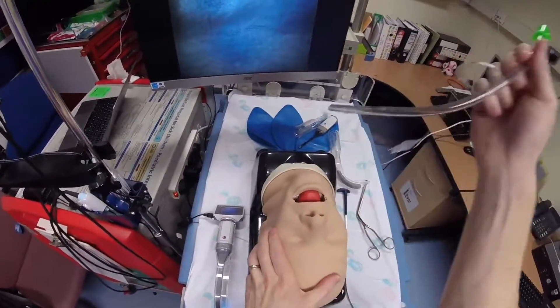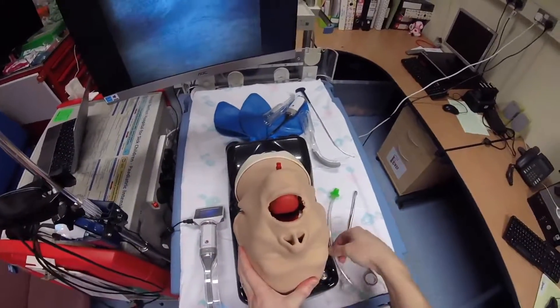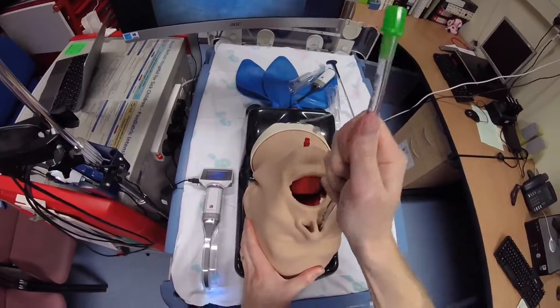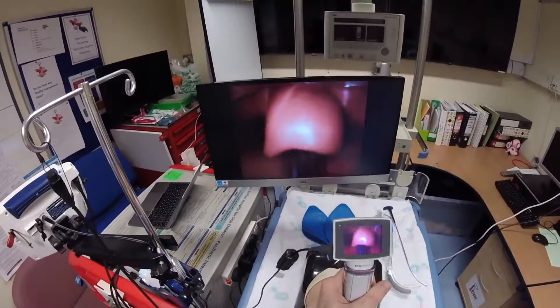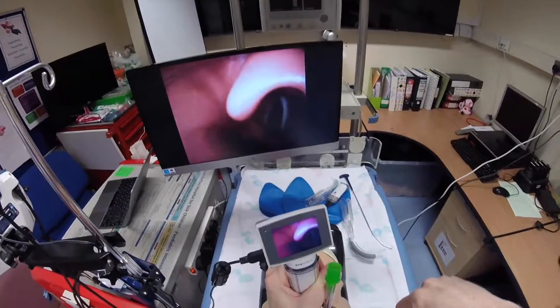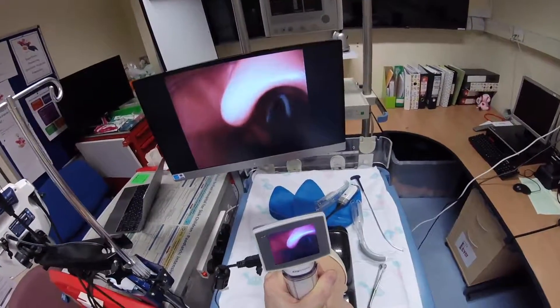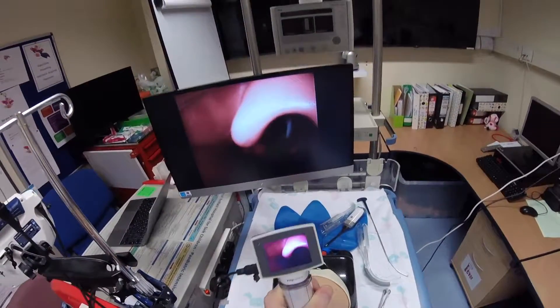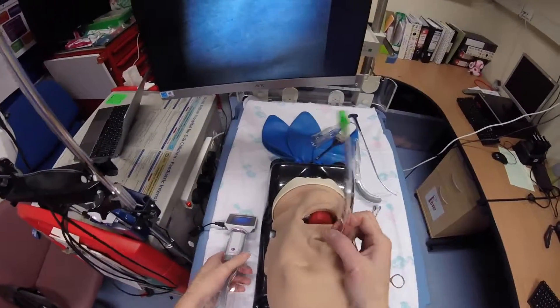Now trying nasal intubation with the adult head. Starting in the easier setting, then trying nasal intubation with the head flexed in the most difficult setting.